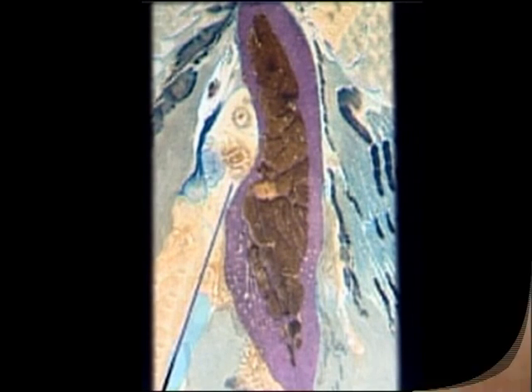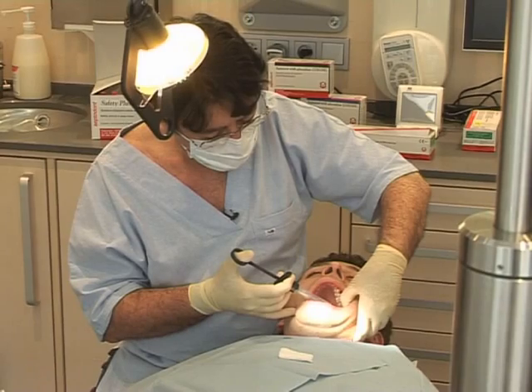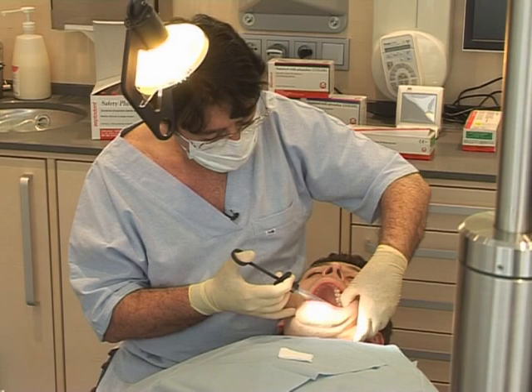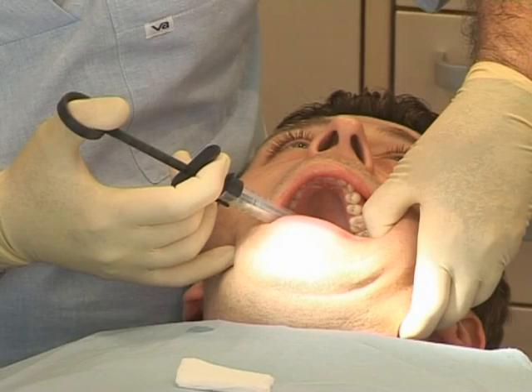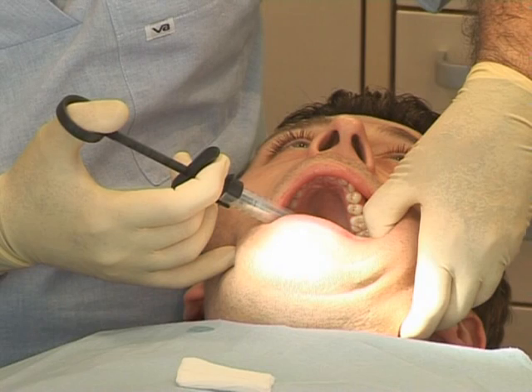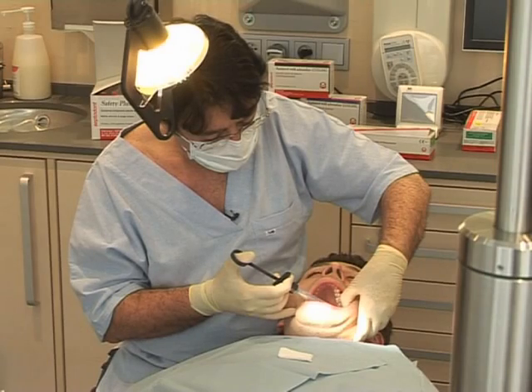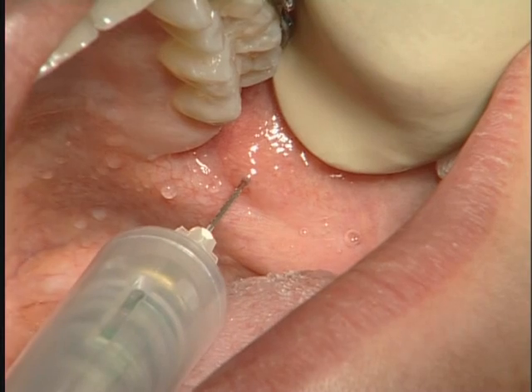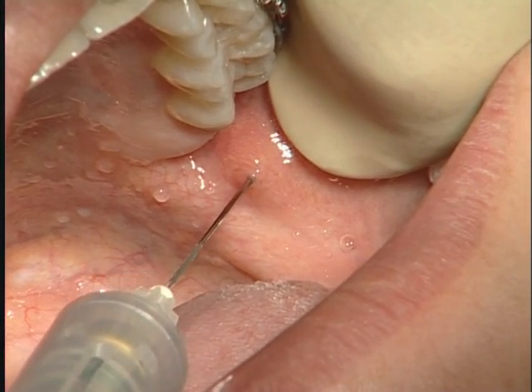Always aspirate before you inject the contents of the cartridge slowly over 2 minutes. A slow injection will save time later. Passive aspiration every 0.5 milliliters will also slow the speed of injection. Your equipment should let you aspirate using one hand, so you keep in contact with the anatomical landmarks for the next sequence.